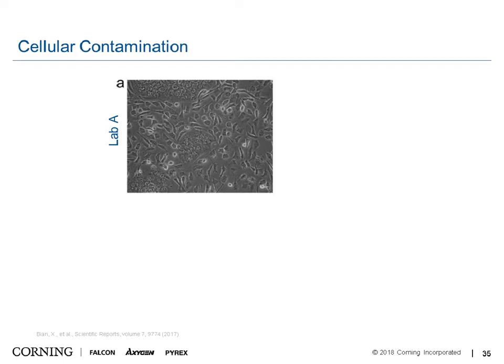How does cellular contamination look? Here is an image of a cell type in culture. With time and experience you start to recognize your cells — you know how they should look and how fast they grow. If you look closely, you can probably see a few cells in the middle with a more round structure, while the others around them are more spindly in shape.